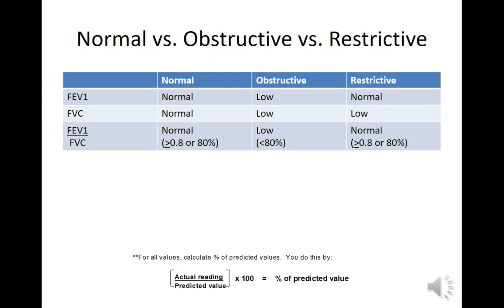Okay, so here we're gonna do some problems. Doing good so far. And here's the values you've already heard of, your FEV1, FVC, and this is the FEV1/FVC ratio. Okay, and of course these numbers have to be given to you. You're not gonna have to figure these out unless I show you a really good FVC that has really good lines on it and you can tell the volumes clearly.